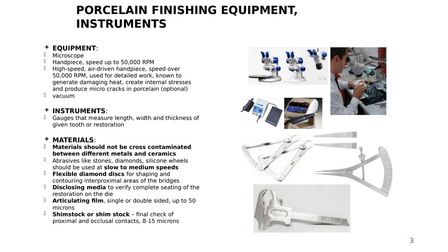So it gets hot really fast when we use the high speed and it cracks right away and you cannot repair it. So you have to start all over again. And also a vacuum. So the vacuum is mostly for the ovens, you know.